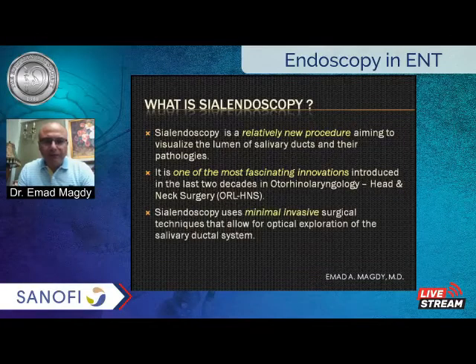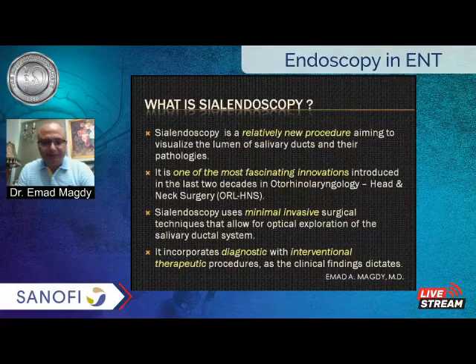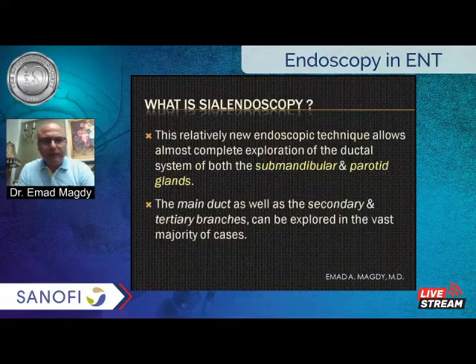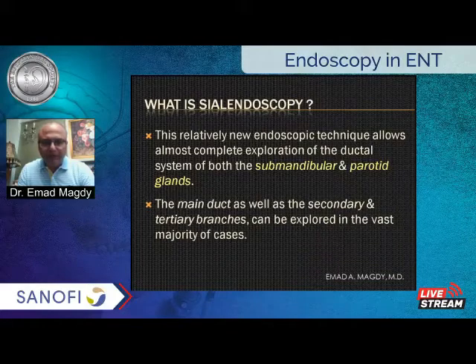It uses minimally invasive surgical techniques that allow for optical exploration of the salivary ductal system, and its beauty is that it incorporates diagnostic with interventional therapeutic procedures as the clinical scenario dictates. This relatively new endoscopic technique allows almost complete exploration of the ductal system of both the submandibular and parotid glands. The main duct, as well as the secondary and tertiary branches, can be explored in the vast majority of cases.